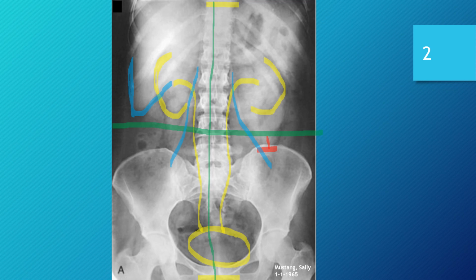The answer to that is yes and no. Is it free from external artifacts like clothing, folds in the clothing, or equipment, or keys, or dimes, or anything of that nature? Yes, it's absolutely free from external artifacts that could be removed. However, it does have some internal artifacts which we can't actually do anything about, and those are in the form of the bowel gas in the patient's belly.